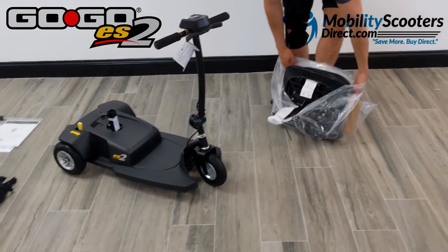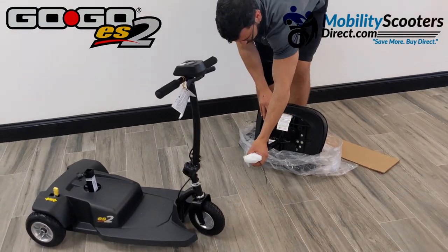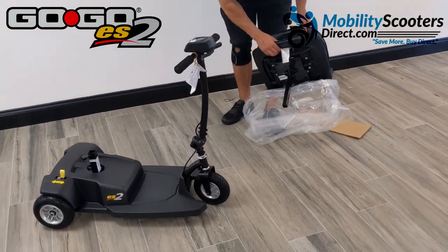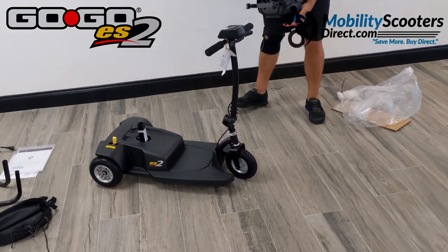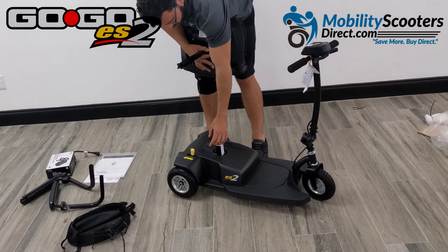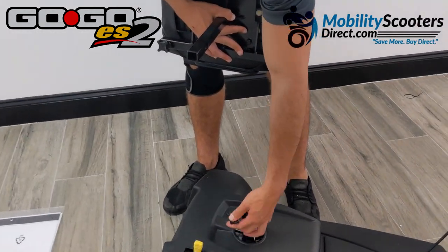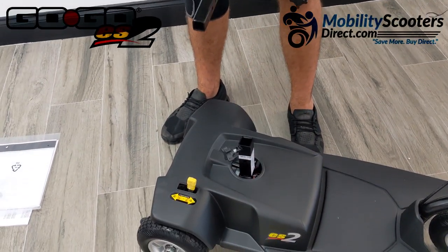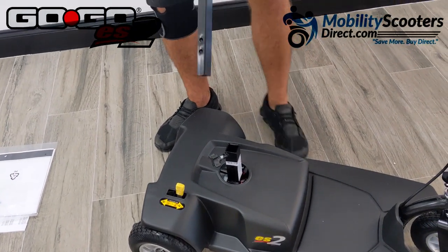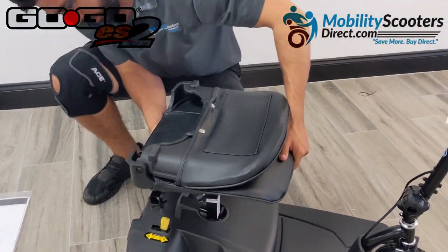Next, we're unpackaging the seat, which we had put to the side earlier. It comes nicely protected with some styrofoam sheeting, a plastic sheet, and a piece of cardboard. The seat is very easy to install — it has a rail that goes into a sleeve, and there's a knob on the sleeve fixed to the base of the scooter. You'll want to loosen that knob all the way, otherwise the chair post will not slide in.